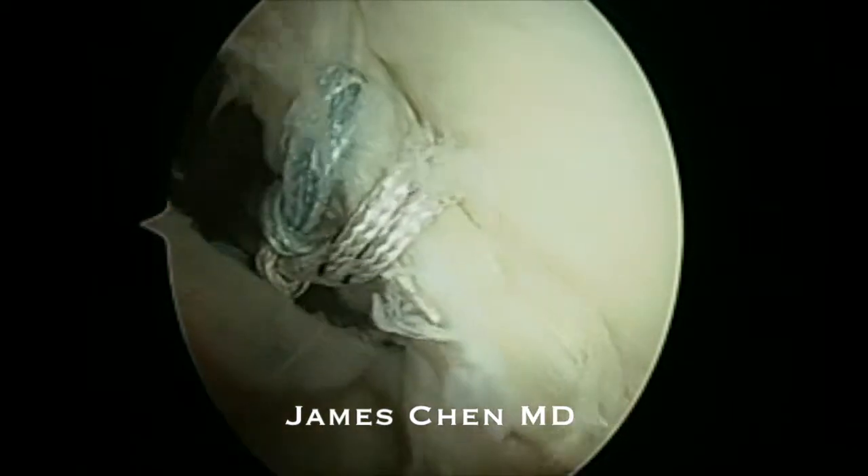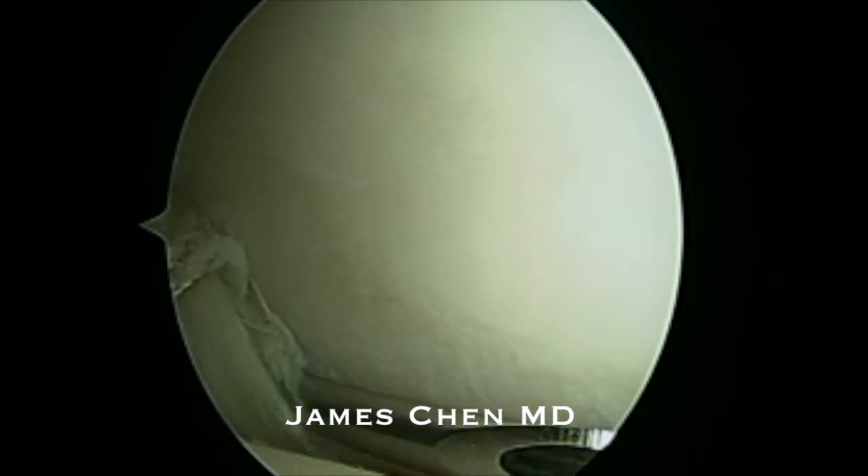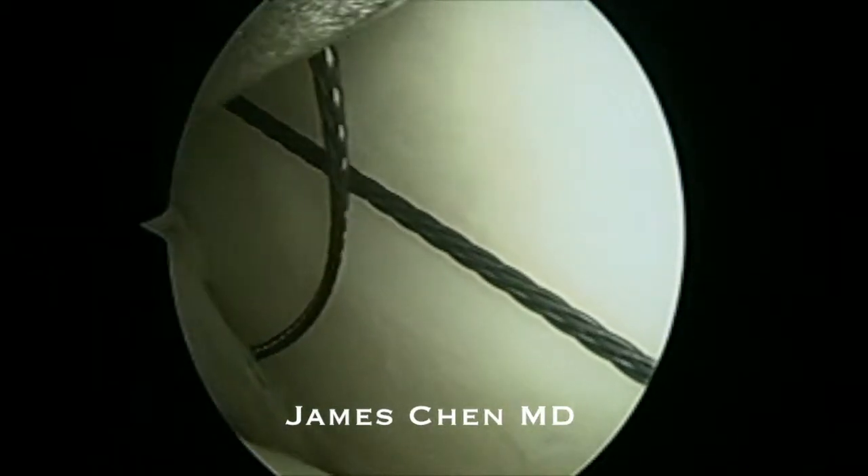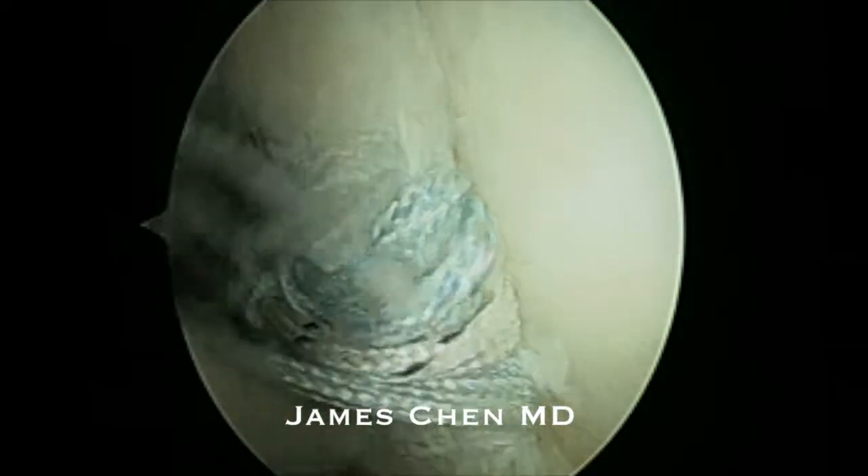So I have two sutures in the labrum. I then put a third pass inferiorly through the labrum, pass another suture, and create a racking hitch stitch.